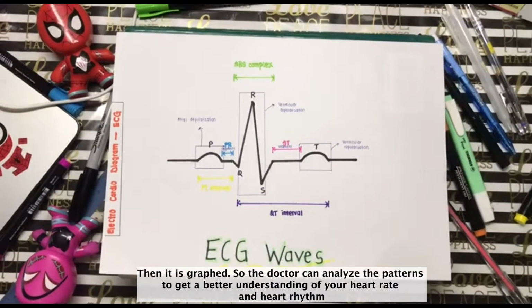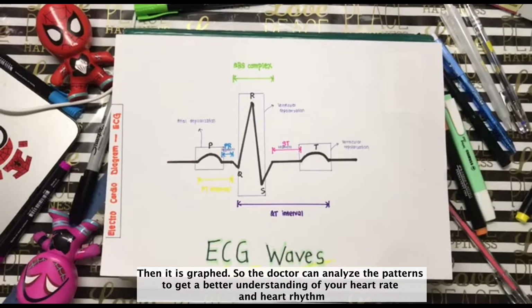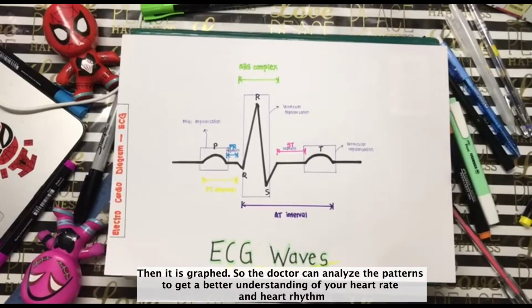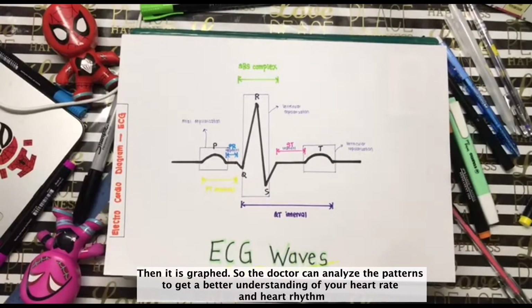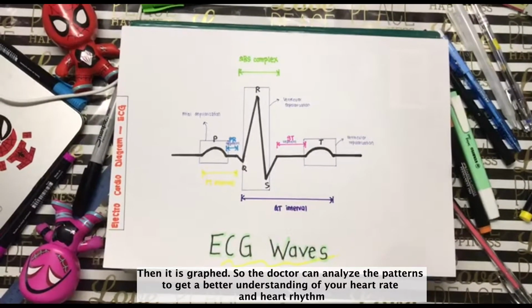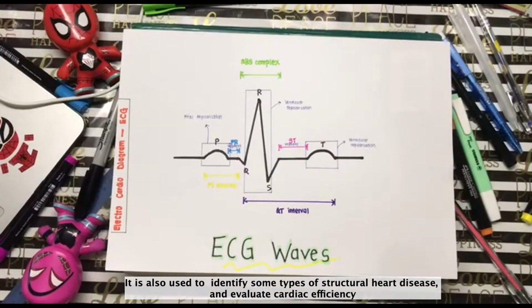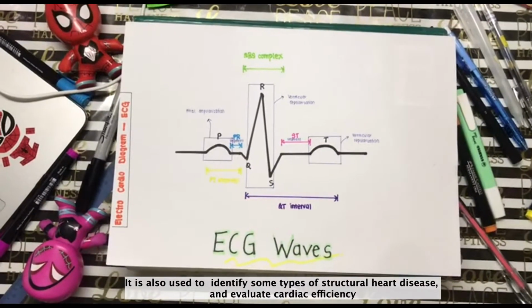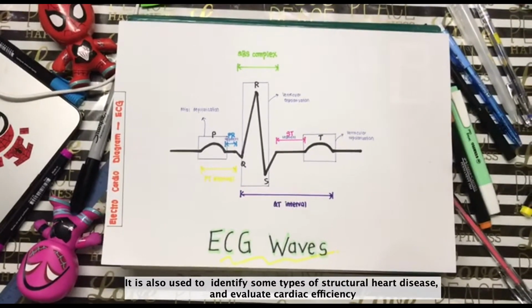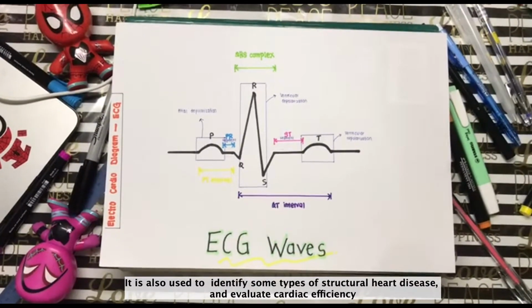And then it is graphed, so the doctor who analyzes it can analyze the patterns to get a better understanding of your heart rate and beat rhythm. And it is also used to identify some types of structural heart disease and evaluate for cardiac efficiency.